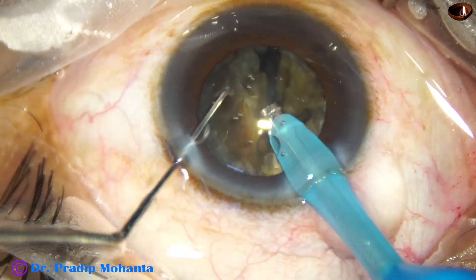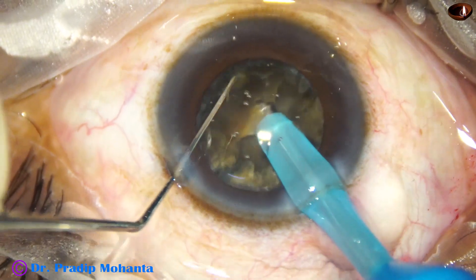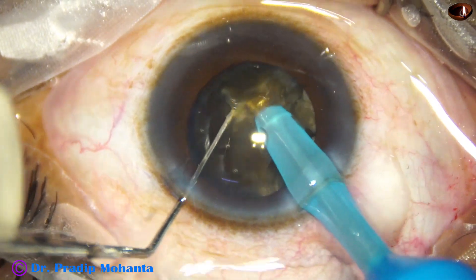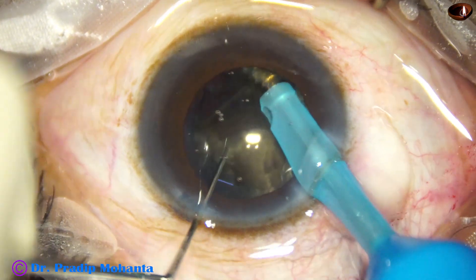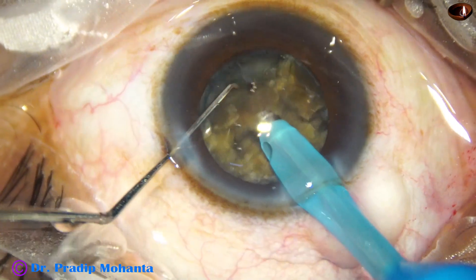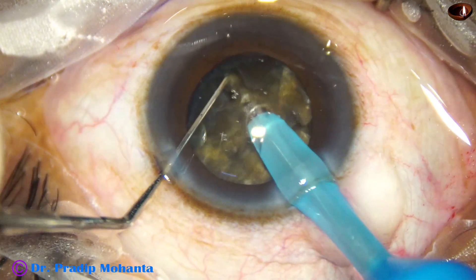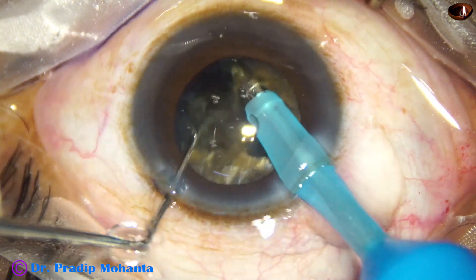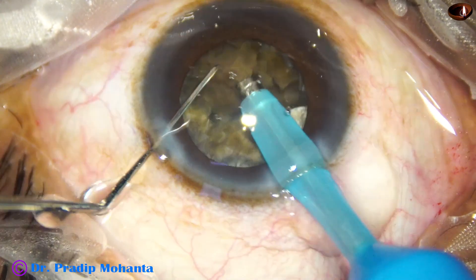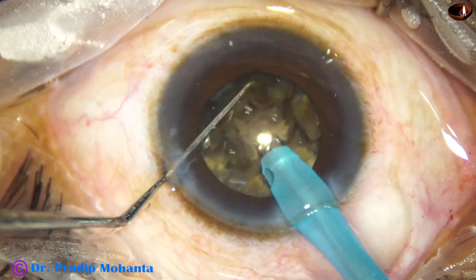And now I come to the other hemi-nucleus. The principle is the same — the FACO needle goes through the substance of the nucleus near the equator, and the chopper is used to divide the nucleus. And here it is: I have got six pieces out of this very hard nucleus.